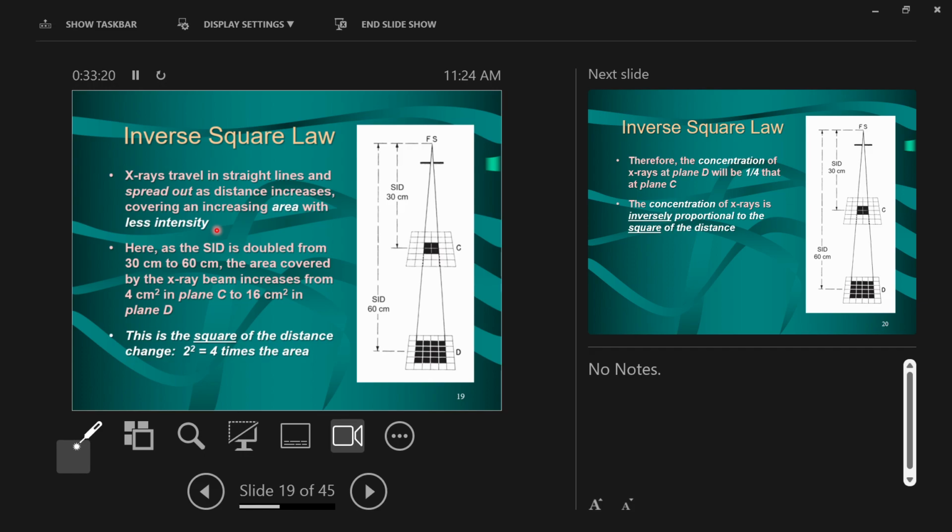Said in another way, I can shine the light at my hand and it's very bright on my hand, and as I move it away from my hand, notice the light beam spreads out, and then if I were to just be here, if I were to measure the light intensity on my palm, right? The light intensity is high now, right? It's kind of actually warm right now on my hand, right? And as I back away, that same amount of light now spreads over a much larger area.